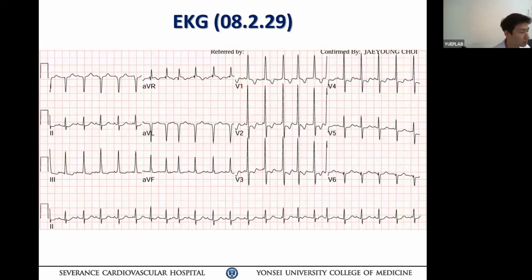So more likely JET, in a patient who has right ventricular hypertrophy or severe right ventricular hypertrophy, like some obstructive lesion on the right side, or hypoplastic left heart, or dextrocardia.